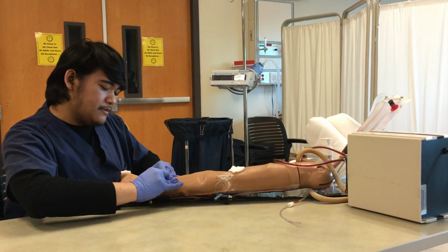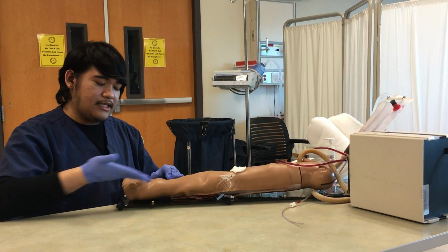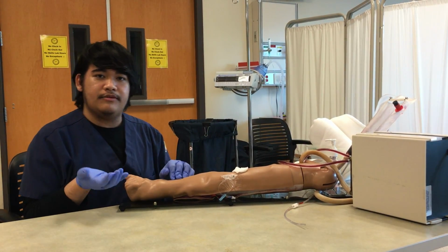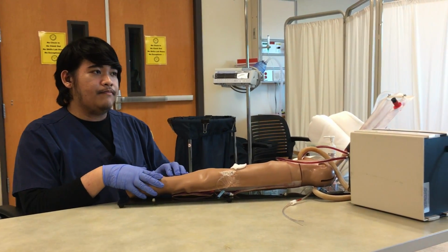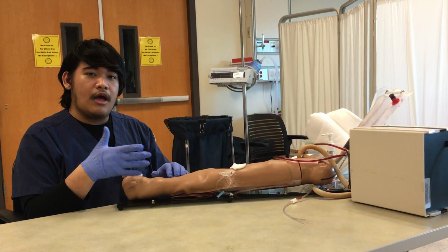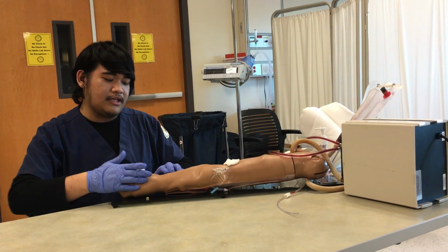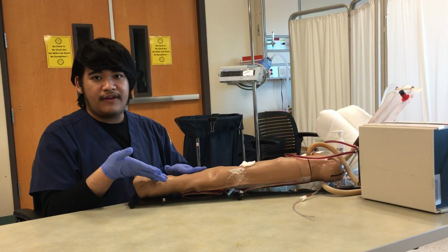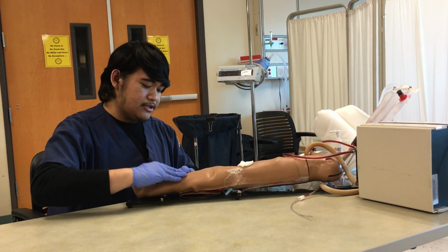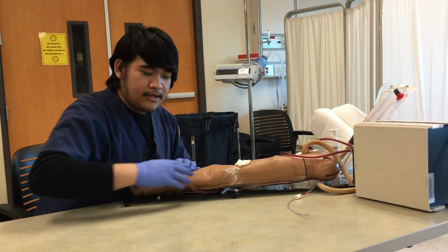Once we see discoloration, we could let go of the ulnar and see if there's any blood return on the hand. If there is color coming back into the hands, we could go ahead and do the procedure. So at this point, this patient passed the modified Allen's test, so I could do my ABG testing.